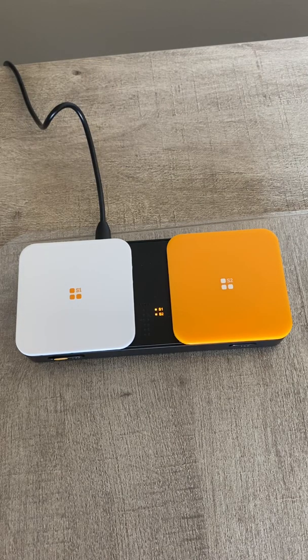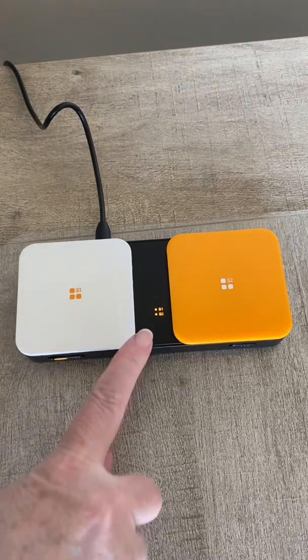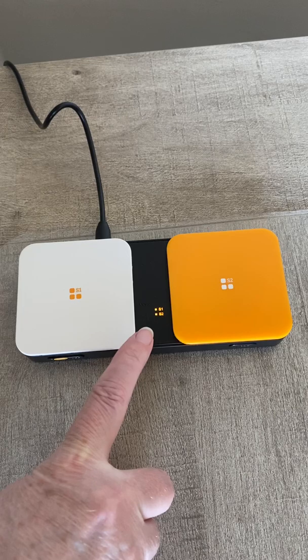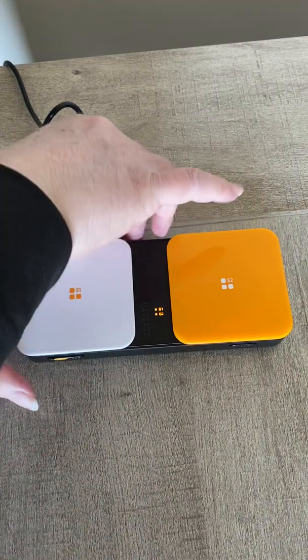First, you need to make sure that your Bluetooth switch is charged. You can see here that these lights are staying lit, so I know that it's fully charged. So I'm going to unplug it.